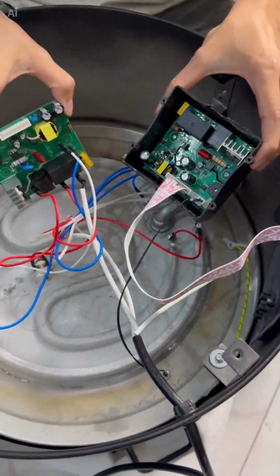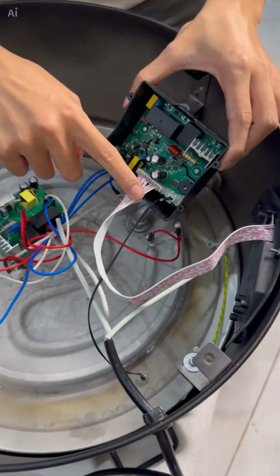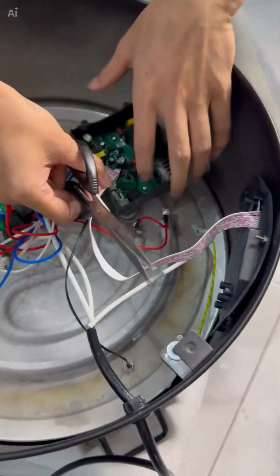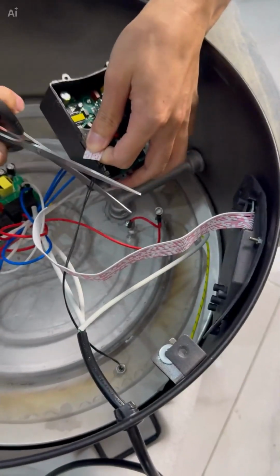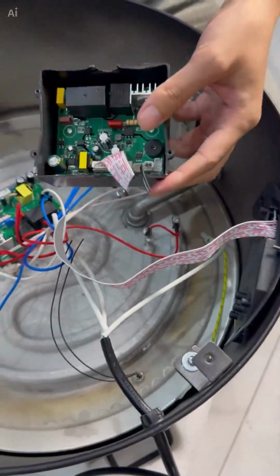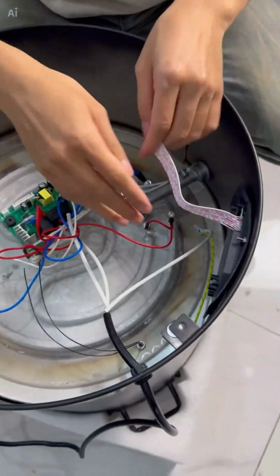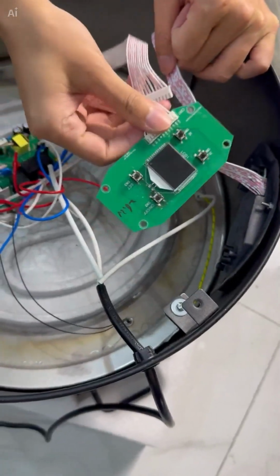Okay, we have just completed the connection of the wires, and now there is 1 ribbon cable and 1 temperature probe wire left. This is the old one, which is no longer needed, so we can use scissors to cut these 2 wires. Okay, and this one. Now we can set the old power circuit board aside. It's no longer needed. Okay, we've just finished cutting the wires, and the next step is to replace this display board, which means replacing it with our new display board.